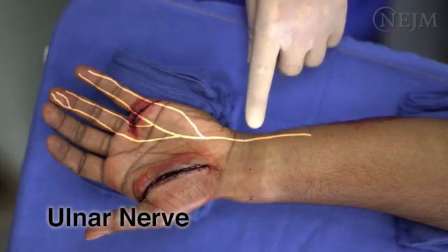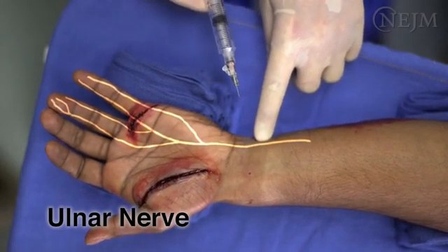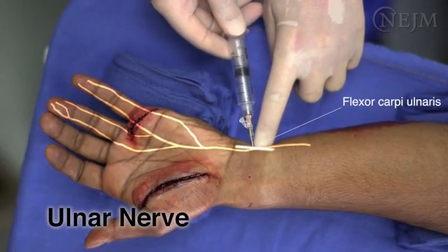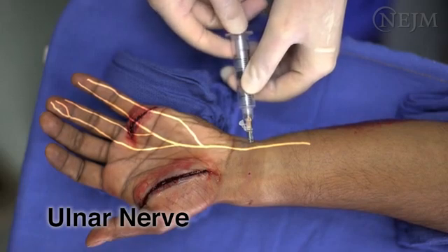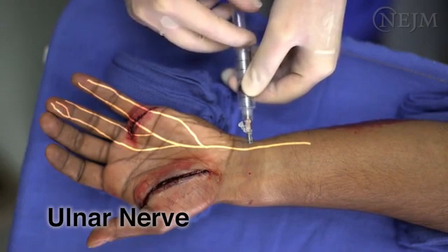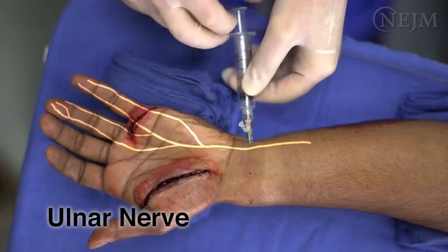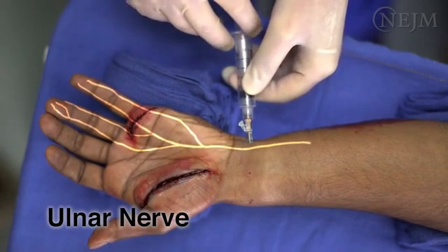To block the ulnar nerve, identify the ulnar aspect of the wrist. Insert a 25 or 27 gauge safety needle beneath the tendon of the flexor carpi ulnaris, just above the styloid process of the ulna. Advance the needle 5 to 10 millimeters and then inject 3 to 5 cc's of local anesthetic. Intermittently aspirate to check for blood. If blood is aspirated, the needle should be repositioned. If the patient reports severe pain or electrical or shooting pain in the 5th or 4th digit, stop the injection.